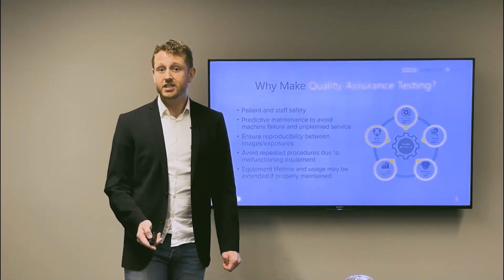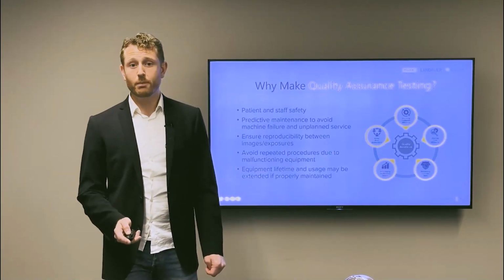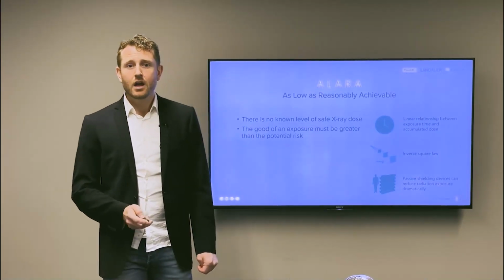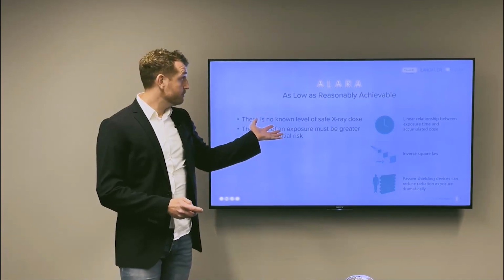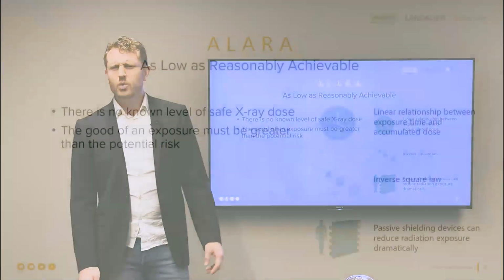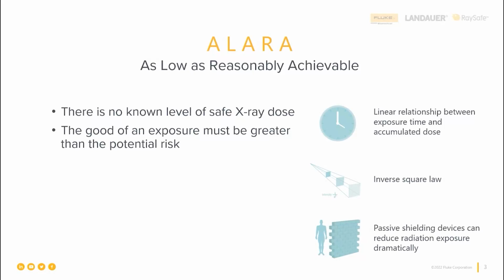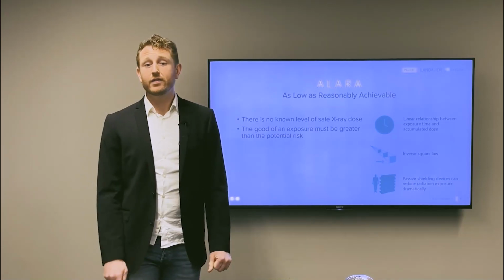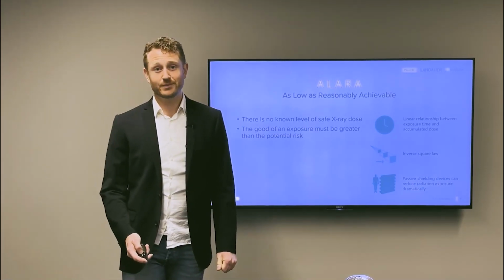And to avoid unnecessary dose should always be top priority if one is working in accordance with the ALARA principle. Most of you are probably aware of this concept, but we must always have this in the back of our mind when discussing today's topic. In accordance with ALARA, one must always do everything one can to keep the dose as low as reasonably achievable. There is no known level of safe radiation, and the good of an exposure must always be greater than the potential risk of the exposure.